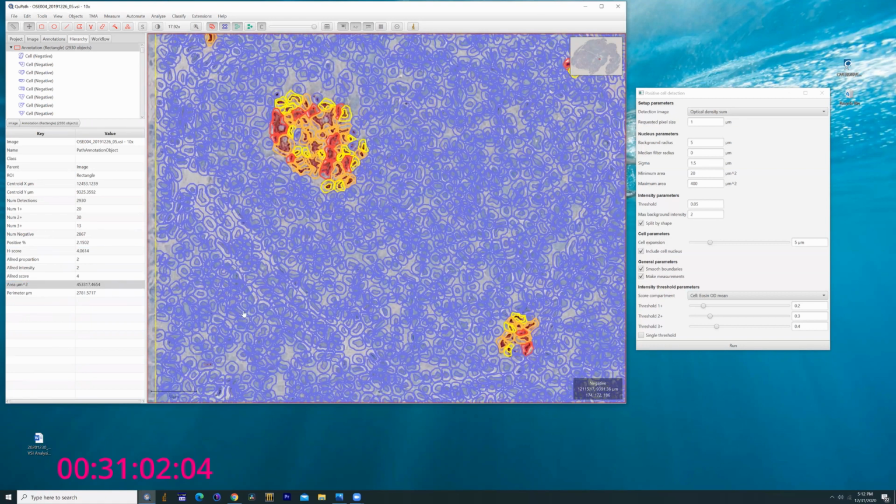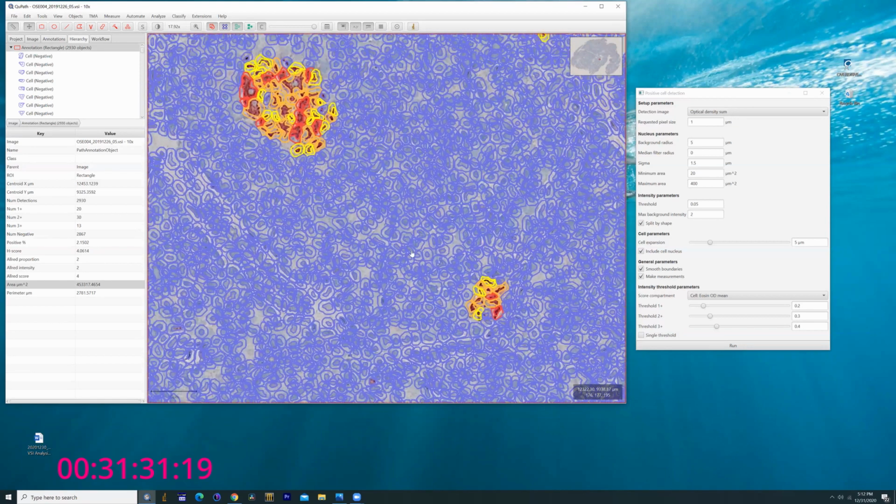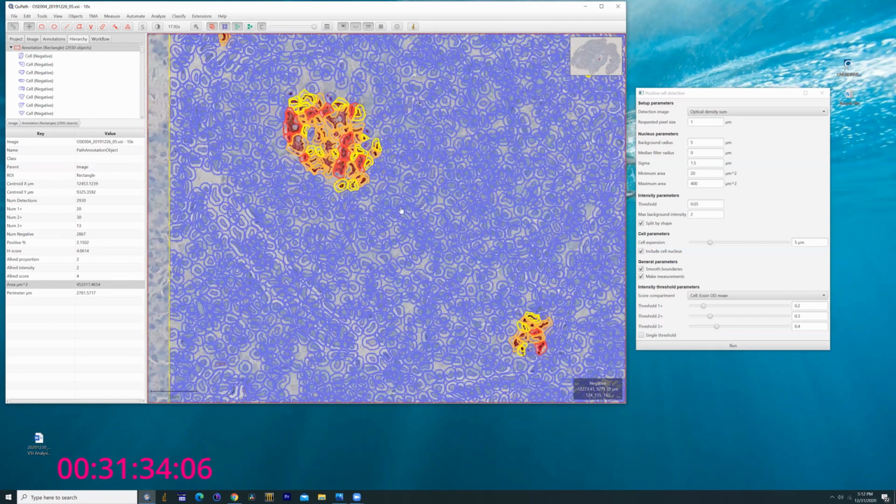The reason for me showing you this is you can imagine how useful this is. You can see there's actually a maintenance of scale all through this, which is a considerable improvement over my older methods where I'm taking files, exporting them into a secondary format, trying to mask out a specific color so I can then import it into ImageJ. Meanwhile, I'm losing all of this metadata related to scale. So it becomes this whole process to try to scale the image back in. This idea of surface area, or even an average cell number, is quite difficult to do once you start stripping all the metadata away from the initial image.